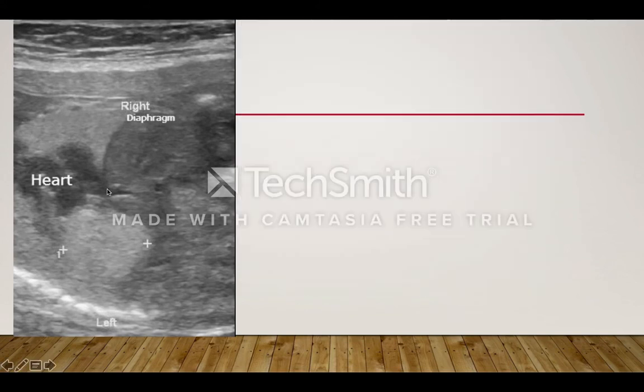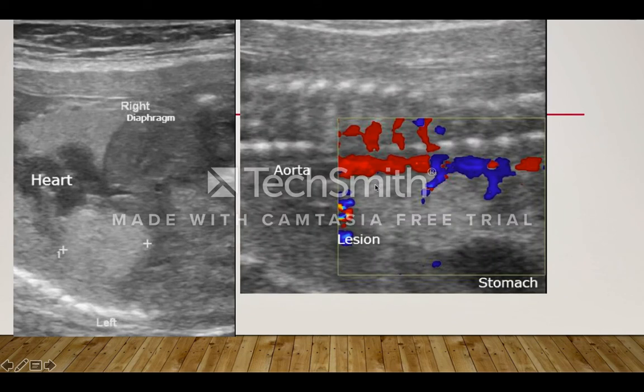This is the sonogram coronal view, which shows the right hemidiaphragm, right lung, heart chambers, and this is the left lung. This is the well-defined echogenic mass located in the left lower lobe. This is a coronal view with color Doppler ultrasound showing the abdominal aorta, which shows color flow, and there is also extension of the color flow to the lesion.